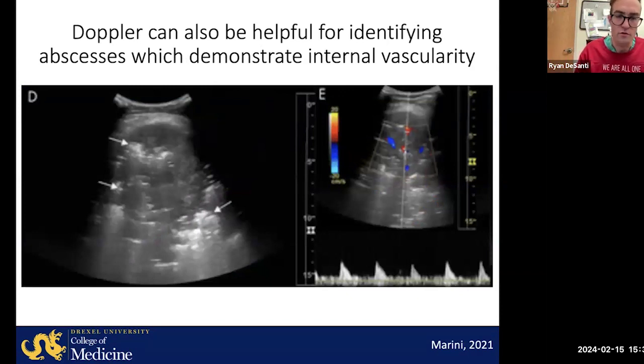This is not used too much, though, in pediatric lung ultrasound, because in order to get good images on the color Doppler, patients should typically do a breath hold. Many patients, which we are doing in pediatrics, are not capable of this and are too dyspneic in order to pause their breathing, or not old enough in order to be able to cooperate with the examination. This, of course, will cause a lot of artifact in the examination.